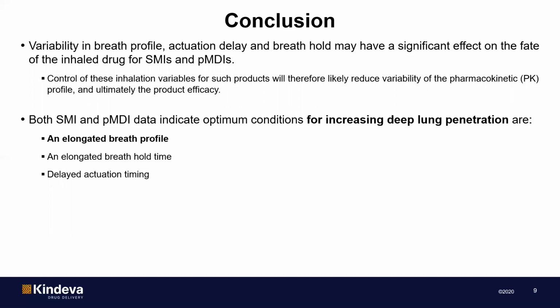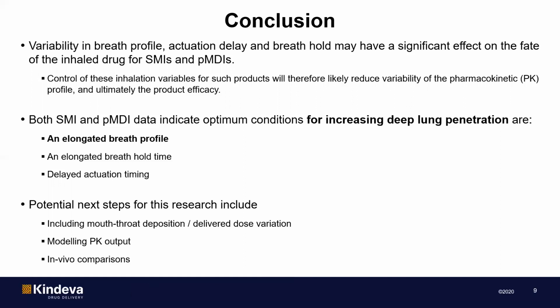And certainly an elongated breath profile seems to help with that. I think there are significant potential improvements to the modelling in terms of factoring in the delivered dose and certainly the throat deposition, and ultimately wanting to model the PK output, which the software is capable of.